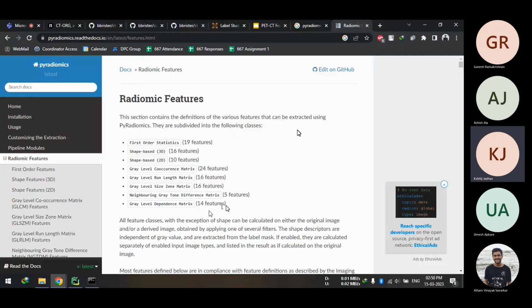No, I'm not saying that, sorry. I'm saying that in your current setup there, you physically do the contouring, right? It does not happen automatically. No, not at all. Okay, and what Atharva is actually developing is to automatically contour it.